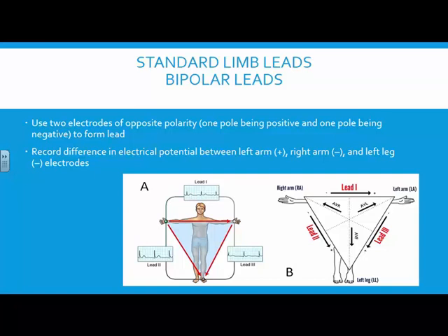Anybody ever looked at a 12 lead? On a 12 lead, you've got 4 rows of 3 leads. Your first 2 rows, or your first 6 leads, that's going to be lead 1, lead 2, lead 3, aVR, aVL, aVF.